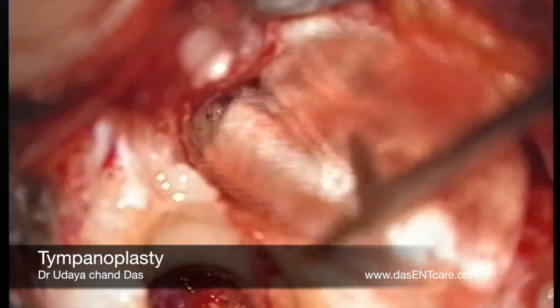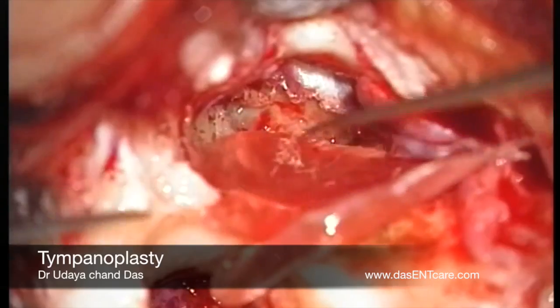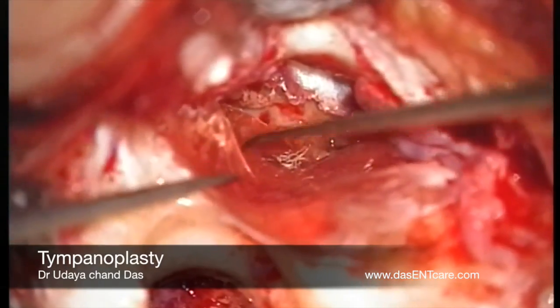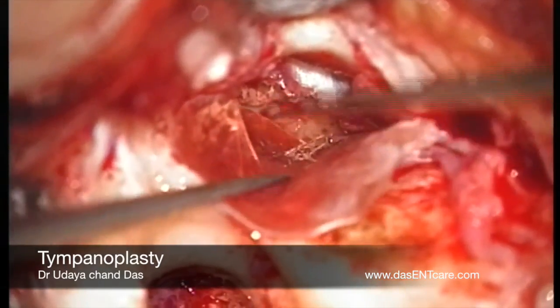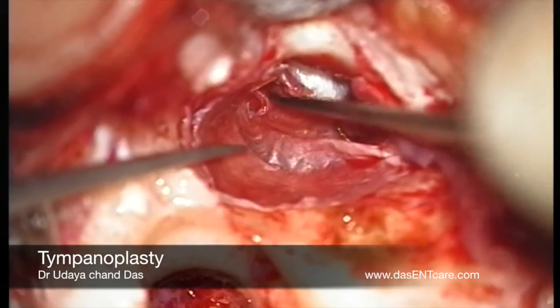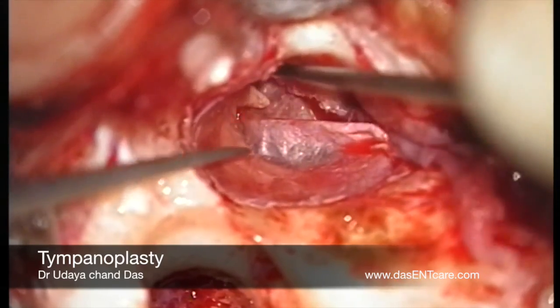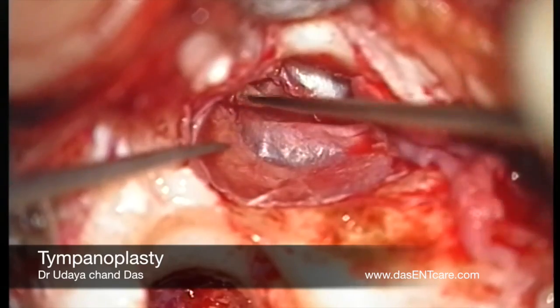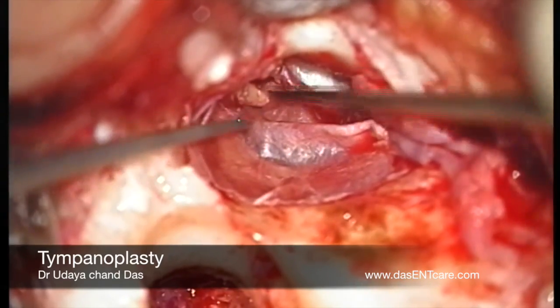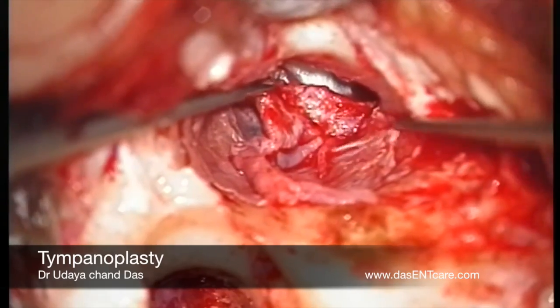A temporalis fascia graft which has been harvested before — a slit is given at the 12 o'clock position. Then the graft is introduced into the middle ear. This slit is important because I am exteriorizing the handle of the malleus. This technique is to ensure that the graft will not move from its place. Now you can see the handle of the malleus which is outside.